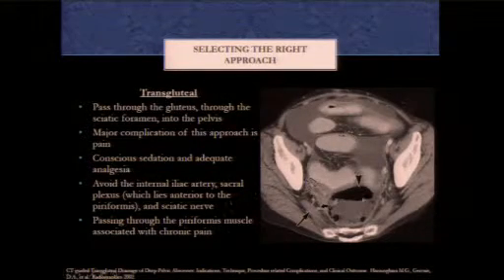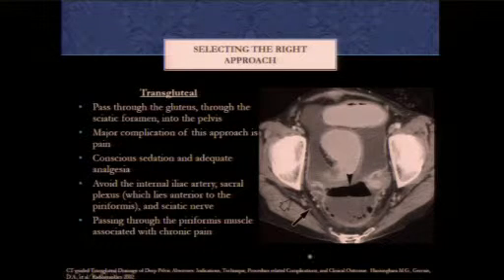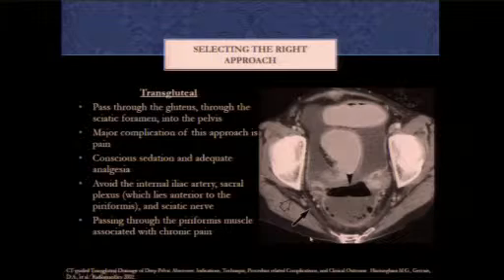So here we have a big collection in the retroperitoneum, and this is the level of the piriformis. So we have the piriformis muscle here. Here's the inferior gluteal artery and the sciatic nerve. So if we go further caudal in this patient, you're now passing through the sacrospinous ligament. The sciatic nerve is off to the side, and if you go just adjacent to the bony sacrum, you can pass into this collection with minimal trauma and hopefully not a lot of post-procedural pain.